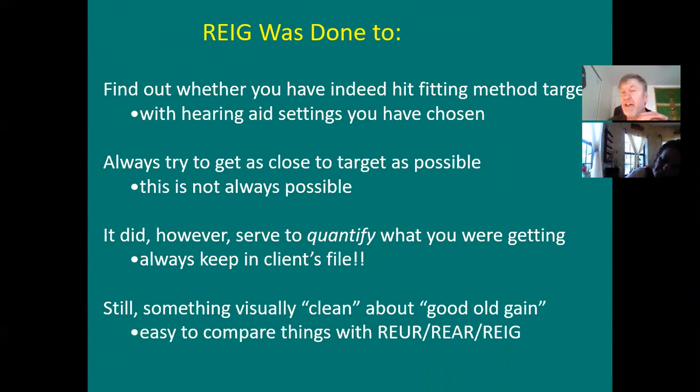You always tried to get as close as you could to the target. This wasn't always possible, but you know what it did? At least it served to quantify what you are getting. And that's the thing about real ear measurement. At least you can see what the client is hearing.